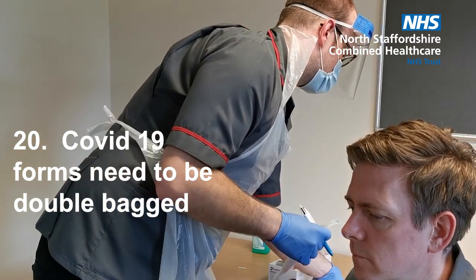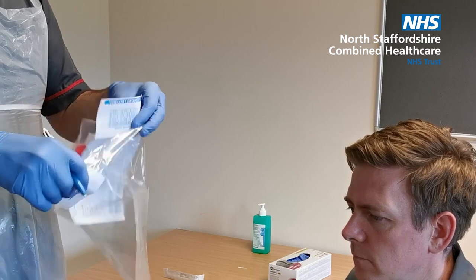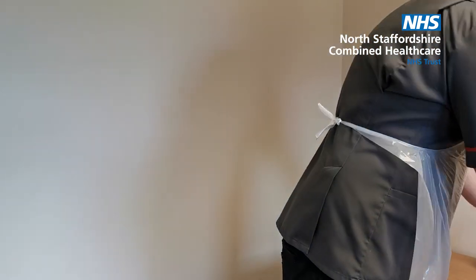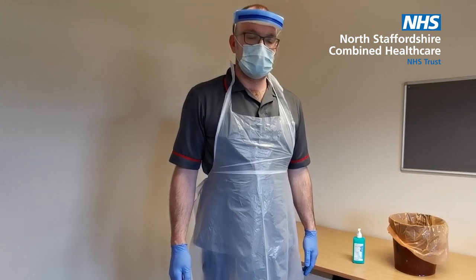And for COVID-19 swabs, you'll need to double bag. This can now be sent to the PATH lab.